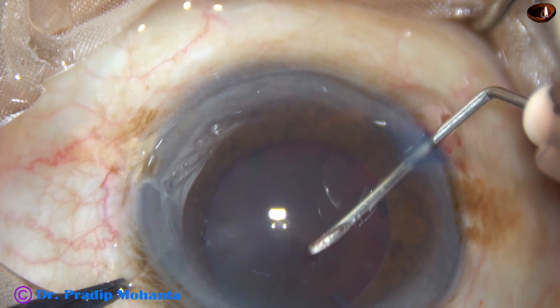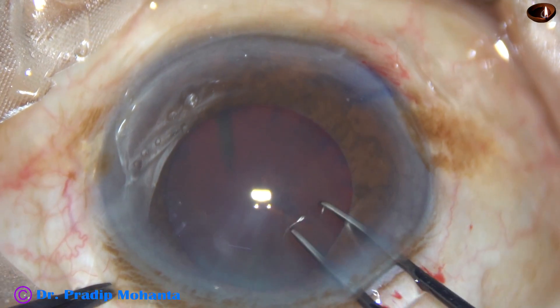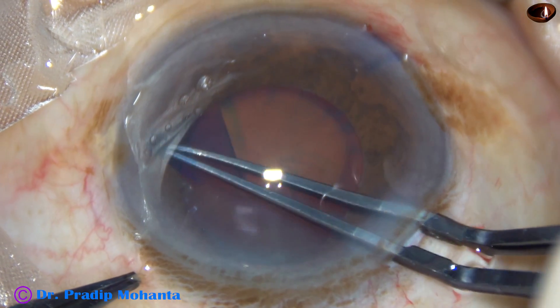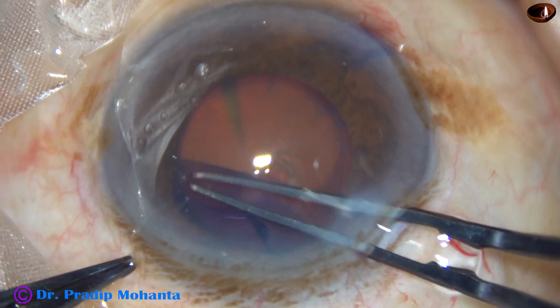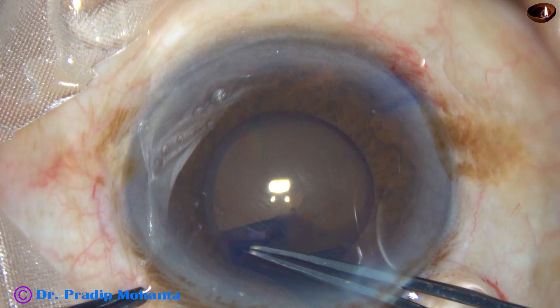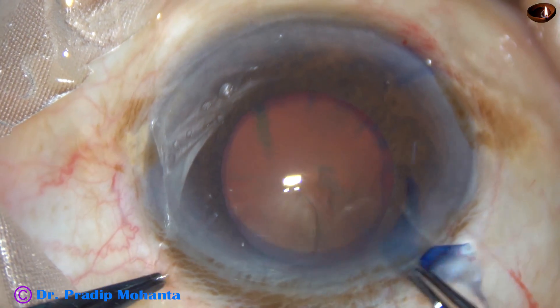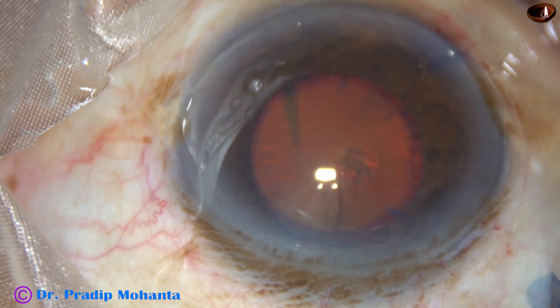Now, as I do the capsulorhexis, the whole capsular bag moves from side to side, indicating generalized weakness of the zonules. If we are not careful in such cases, there can be zonular dialysis and the capsular bag may come out, converting the surgery to ICCE — intracapsular cataract extraction — if we do not take adequate care at the right time.